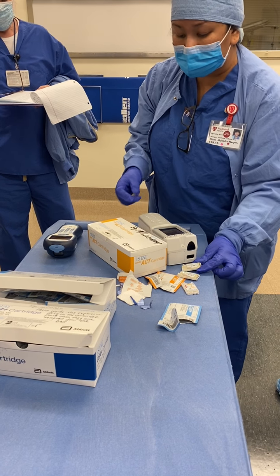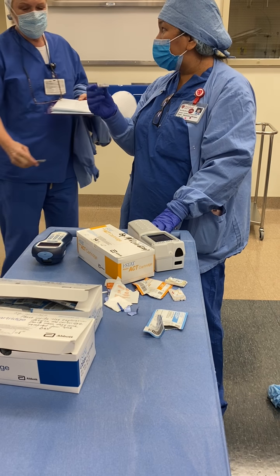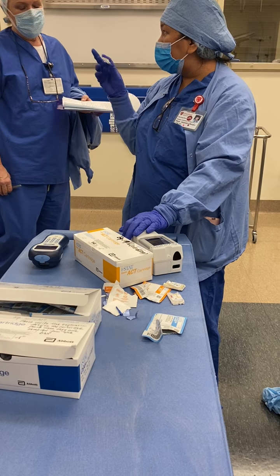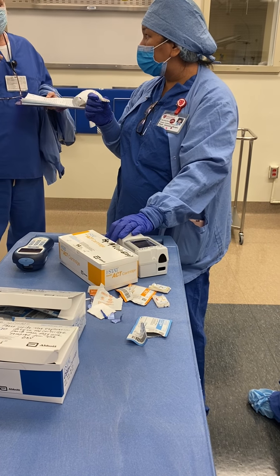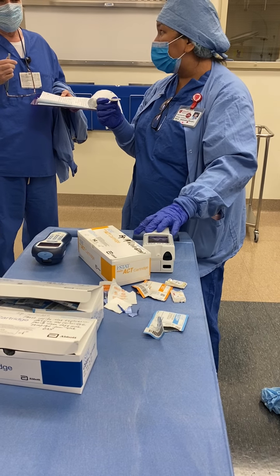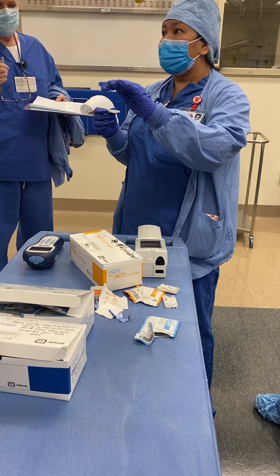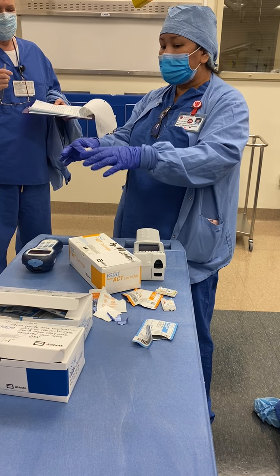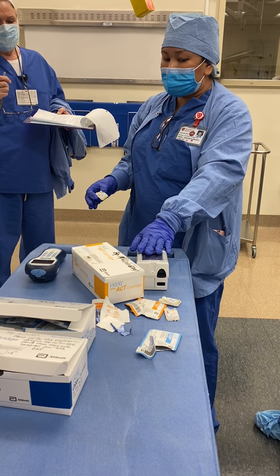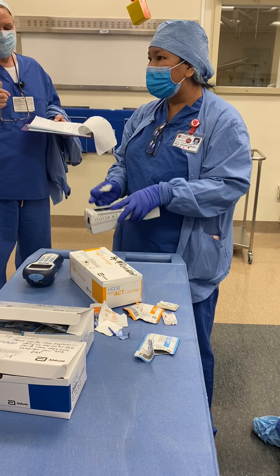Okay. And so where do they keep these devices? In our fridge. In our workroom. So we have a refrigerator in our workroom. Don't the nurses have them in the OR sometimes? No, not all of them. We manage the iSTAT. Cath lab and cardiac have their own in their nursing station or in their core. But all the other rooms, see this, how did this end up here? This is room 33, 500p.